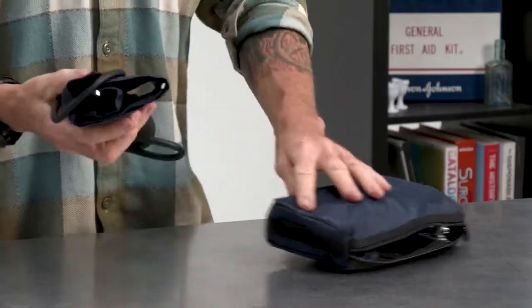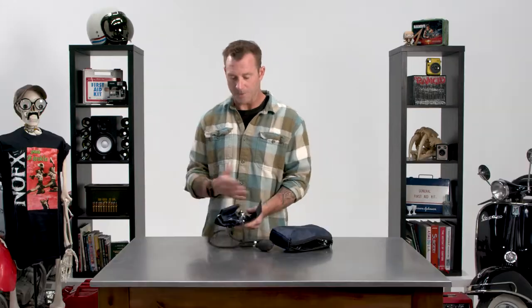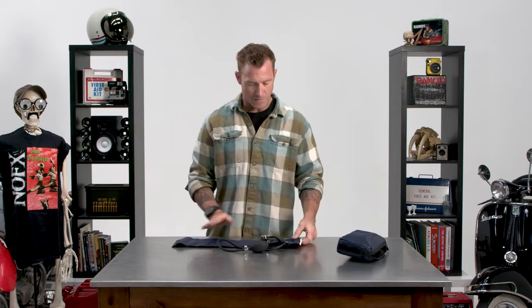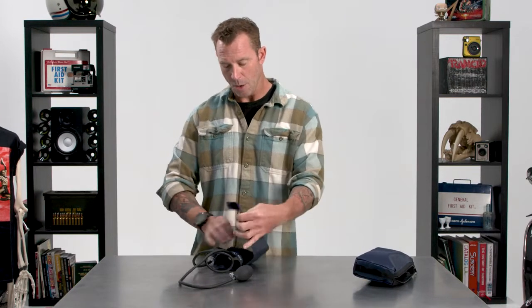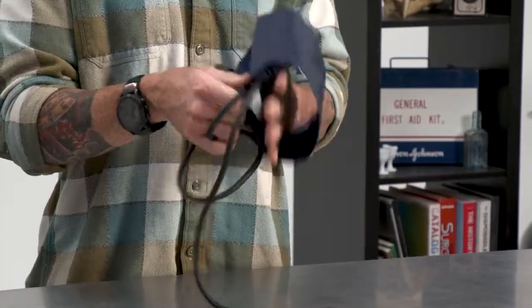Let's start with the blood pressure cuff itself. BP cuff is a great way to shorten it up. If you want to sound super smart, sphygmomanometer — I like BP cuff. A few major parts to be familiar with. You have the cuff itself, which is a nylon material, with Velcro closure. This thing can go pretty small — this is the adult size, but it can go from a pretty small arm all the way to a large arm, so it's got a lot of variability.